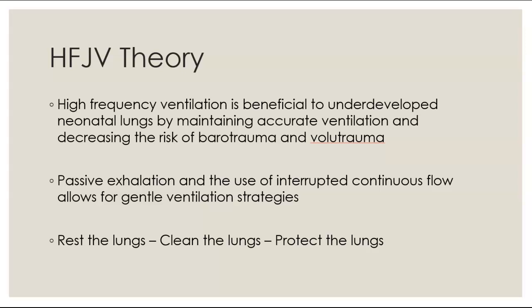So three things. If you're thinking about setting up the jet, do we need to rest the lungs? Do we have just premature lungs that we need to rest and let grow and let this baby kind of develop a little bit more? Do we need to clean the lungs? Do we have meconium aspiration? Do we have some type of weird pneumonia? Do we have consolidations for some reason? Think meconium aspiration. Or do we need to protect the lungs? Are they damaged in some way that we need to protect them while this baby heals and while they get better? Do we need to protect them from further damage or complications? So do we need to rest, clean, or protect the lungs?